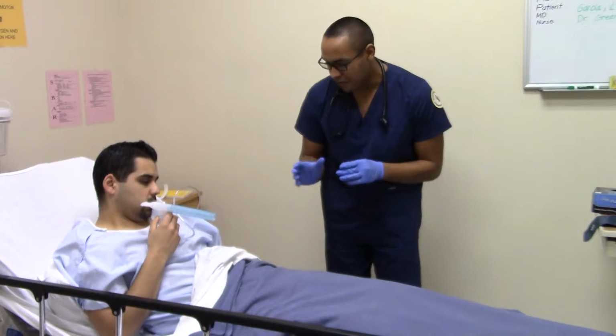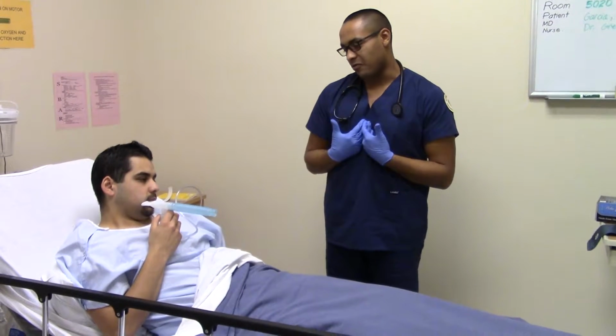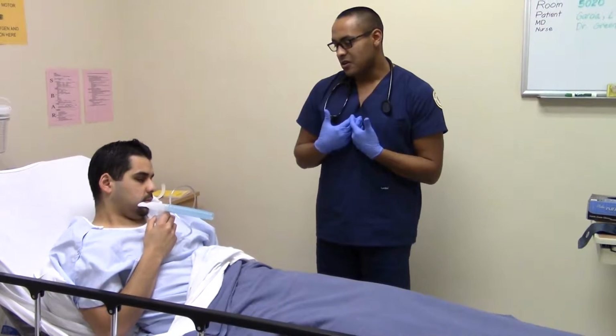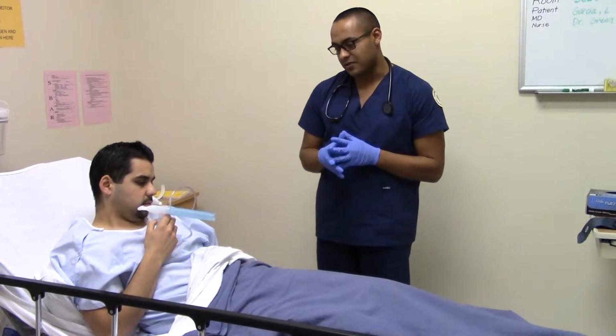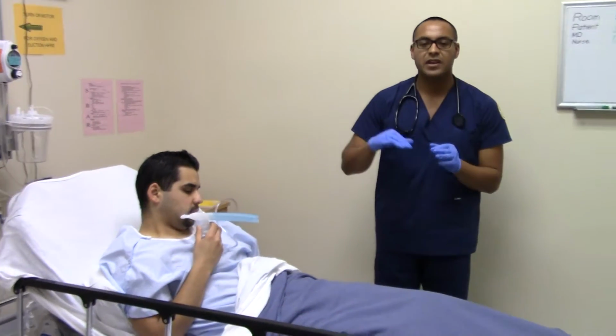And when you can, every 5th breath, go ahead and take a deep breath and hold it for 5 seconds. If not 5 seconds, let it go. Okay. Do it for every 5 breaths. Okay. Get a good position. He does the treatment.